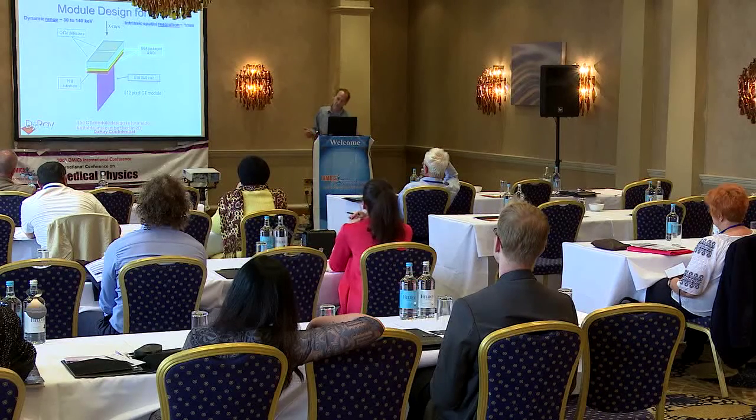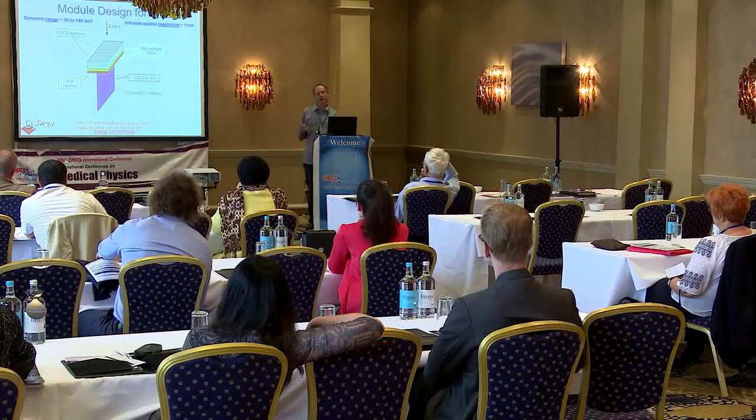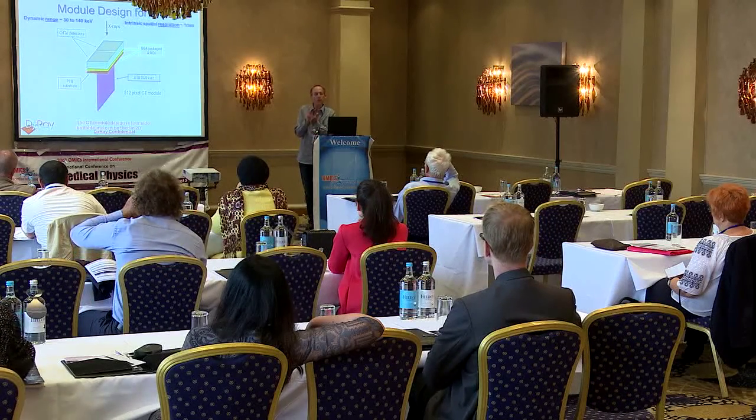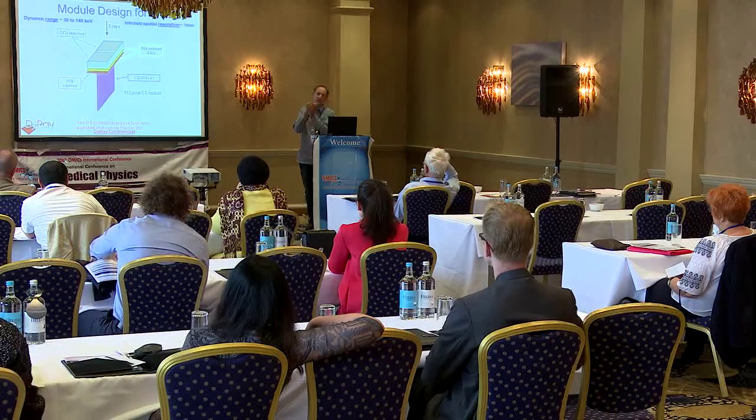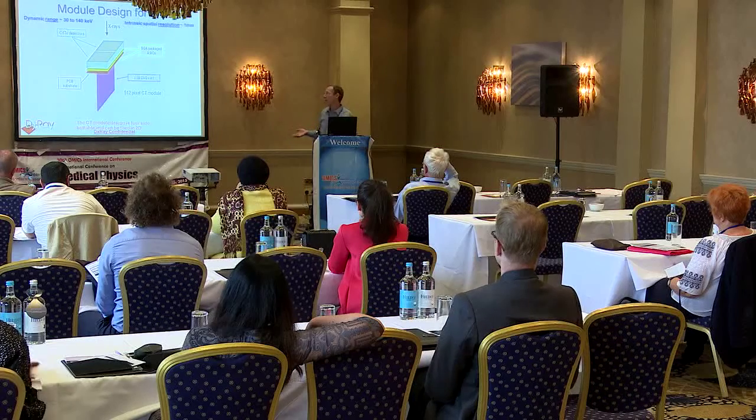And so starting out in trying to develop a detector for CT, a modular design has been used because, as you'll see, with all of these detector technologies, modules need to be formed with little dead space so that they can be tiled together to form the large fields of view that are required.